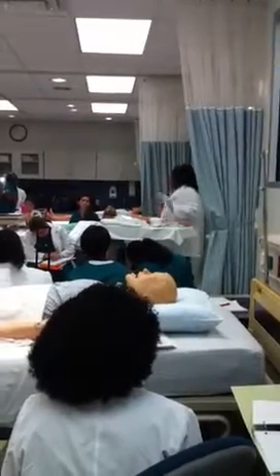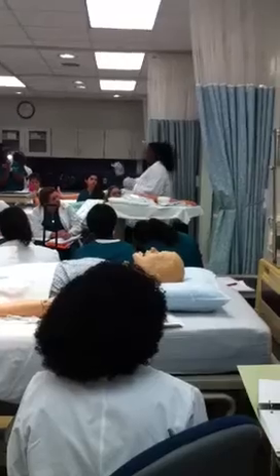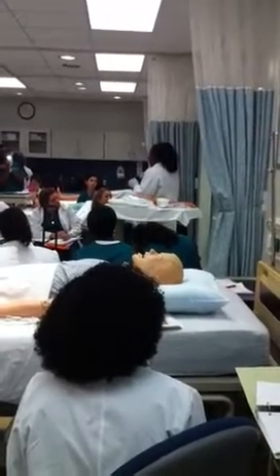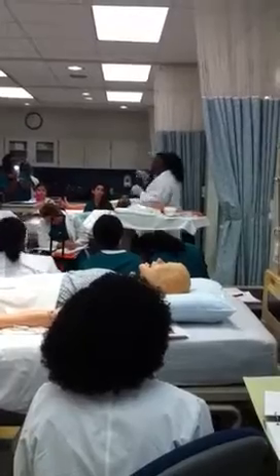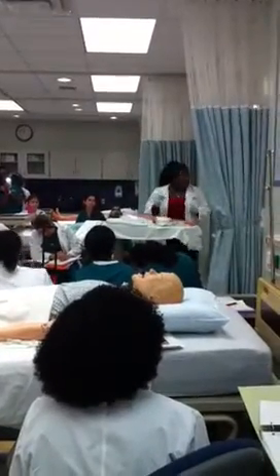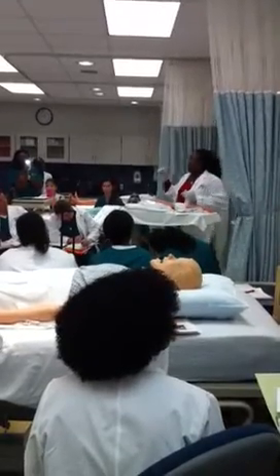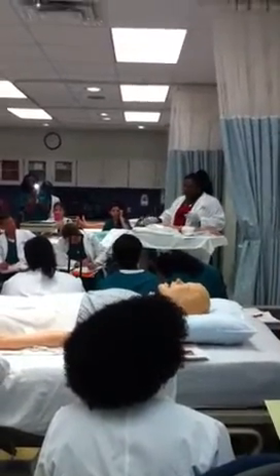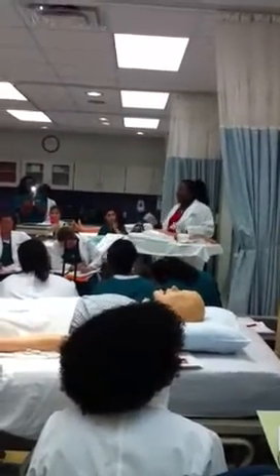Take this like this. Your needle box should be right here. And just don't walk around like this. Like that. And just drop it right there in the needle box. Please do not put your finger in the needle box. Just drop it and it should go down. I think I am looking for a portable one. Just drop it like that in the needle box. Okay? In the needle box.